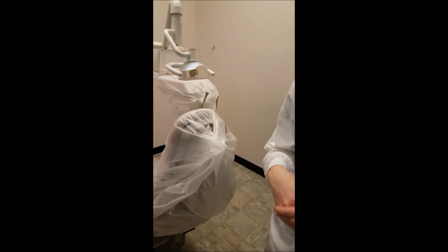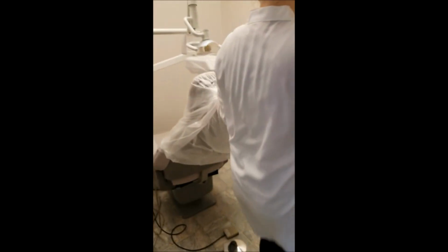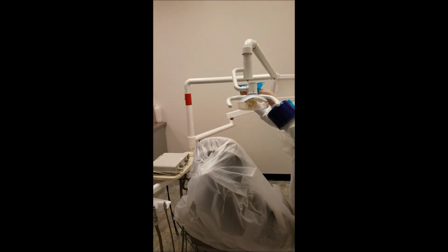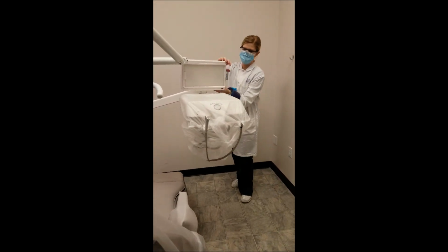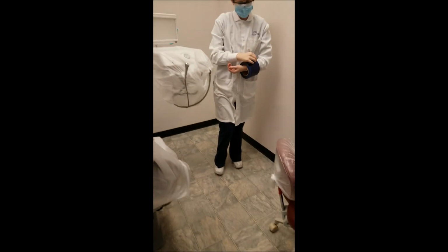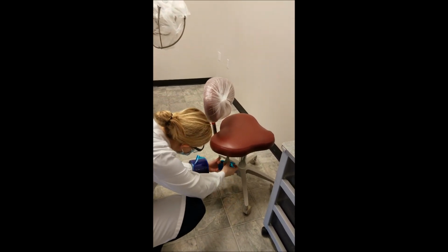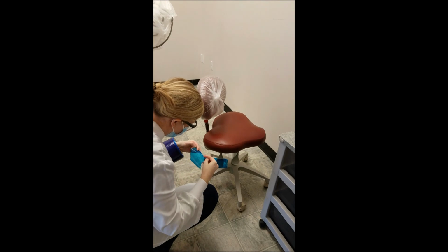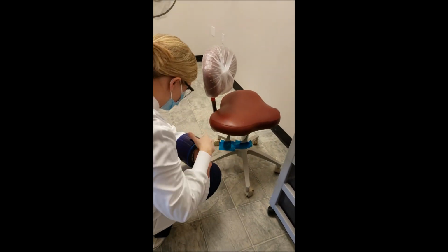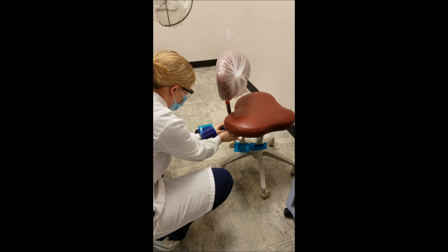Okay, and then she will obtain the blue tape to barrier the light switch, the view box switch, the operator chair adjustment controls, and then on her cart, she will barrier one set of pens.